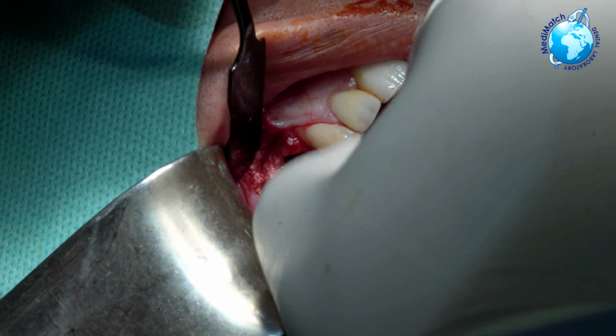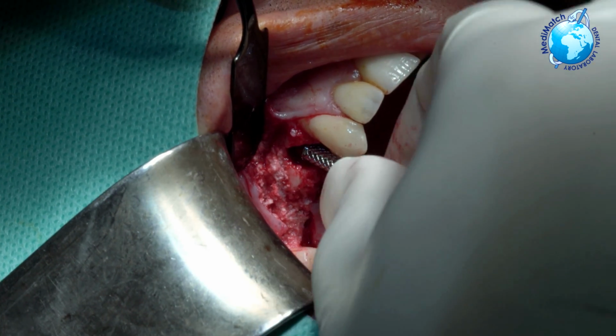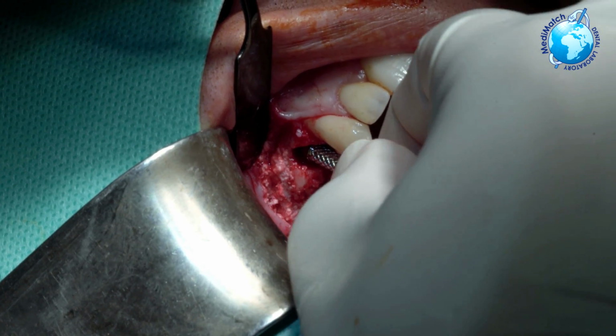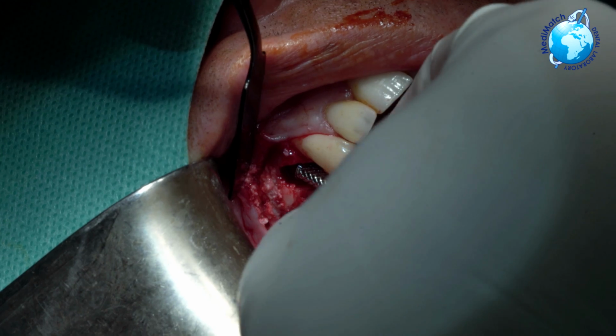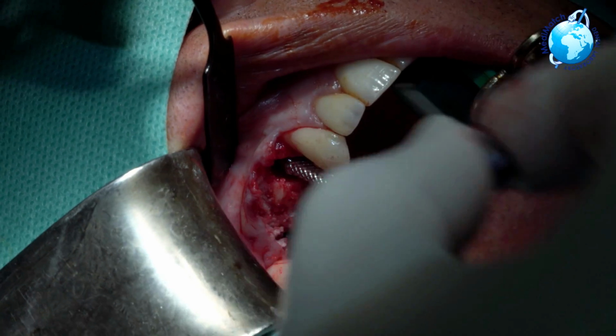Not opening much today. There we go, that's a clear shot. Yeah, so just putting the temporary abutment on. I'm going to shave that down a little bit, all right? And then we're going to put another temporary on there.